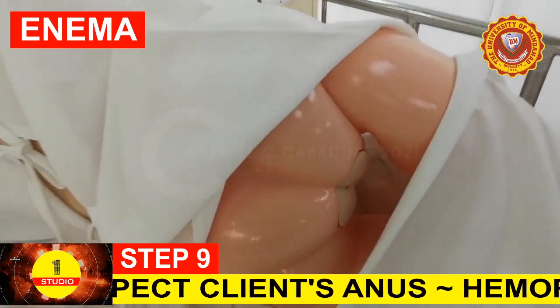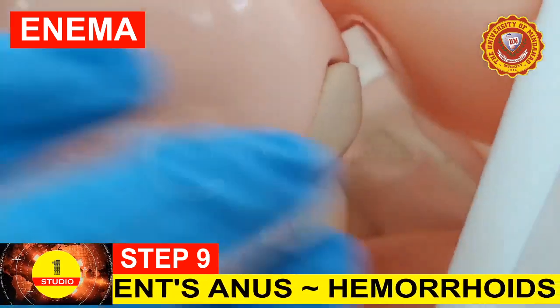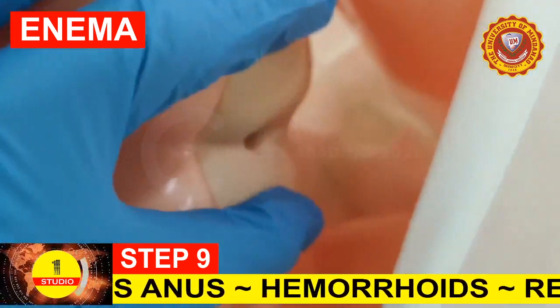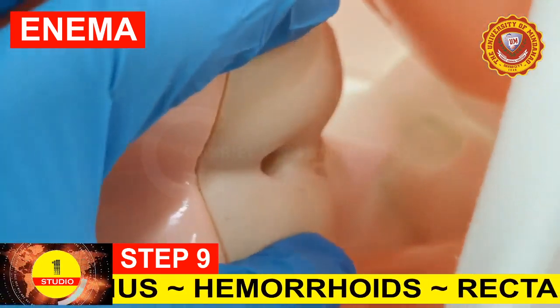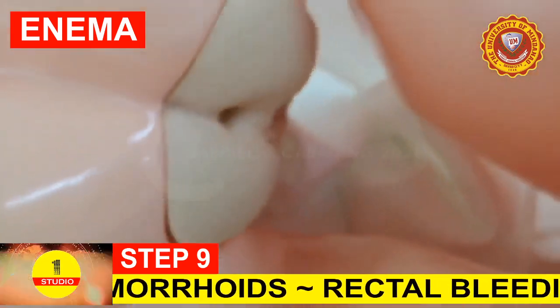Step 9. Inspect the client's anus. Check for any presence of hemorrhoids, rectal bleeding, pain, and abnormal discharges.